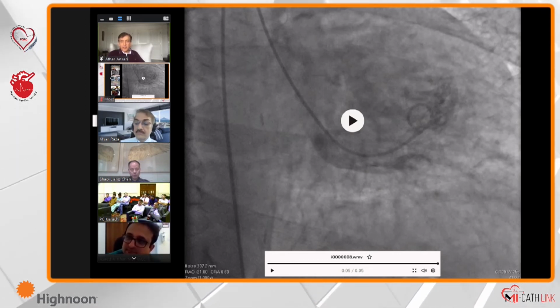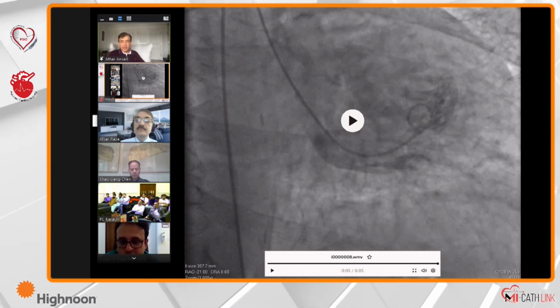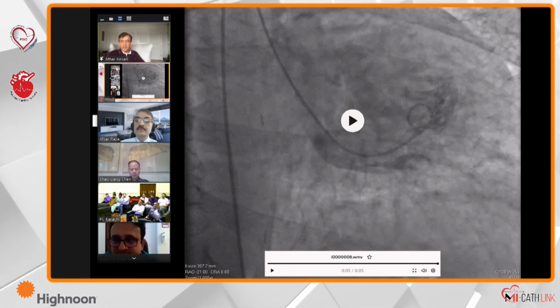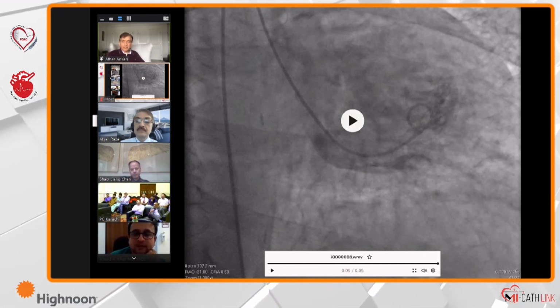And the blood pressure goes down from 110, 120 to about 70. Saturations drop very rapidly from 95 on 2 liters to about 70, 75. He's in acute pulmonary edema, I think just from the contrast dye. So what's the next step we should do now? Put a balloon pump. Put a balloon pump in.